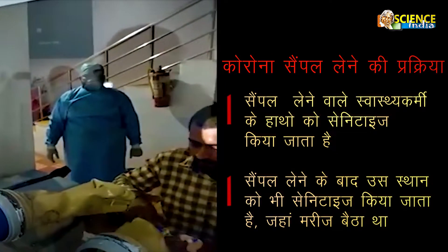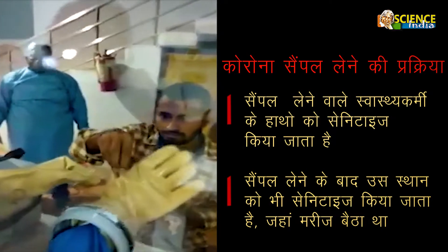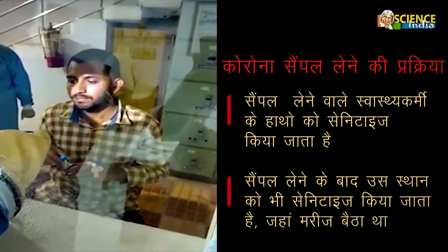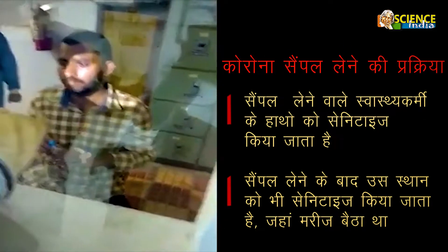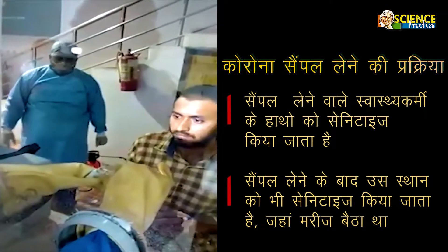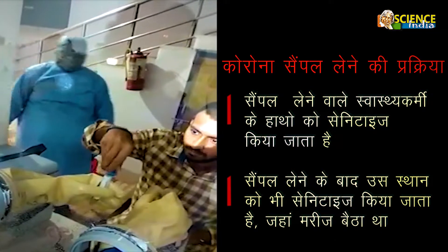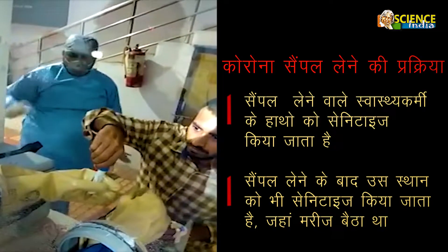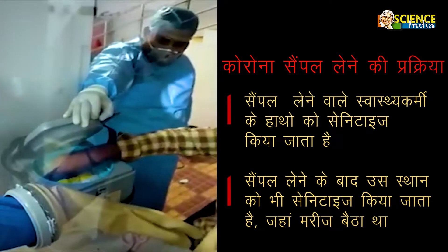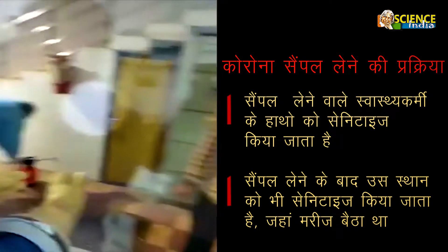He is opening the container and introducing the swab into the bottle having the transport medium along with the swab, which is then placed into the container having ice packs.